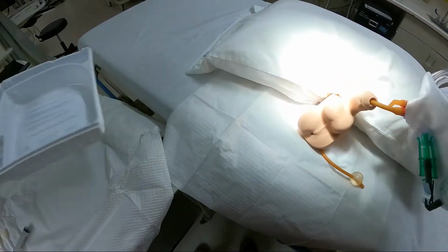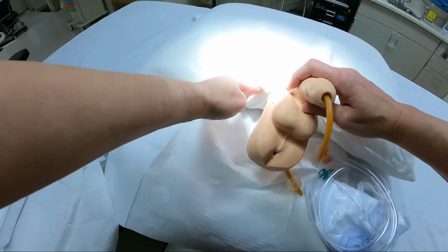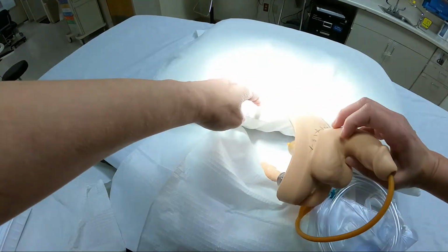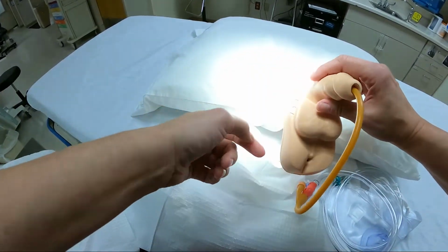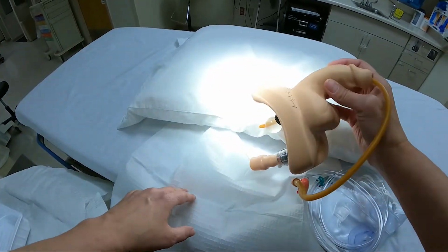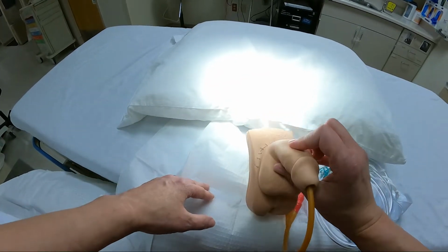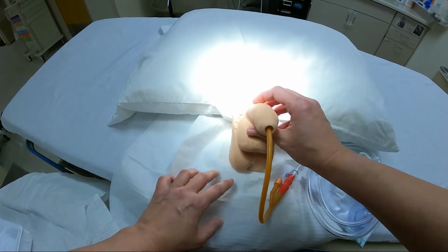Wash your hands. Then you're going to pull this back. Actually, you're going to do that before you put everything away and wash your hands. But you're going to pull this back until it's nicely snug. You don't yank it. You just want the excess to come back. And there you go for the backside view. And this patient has had a very bad trauma, so he's been sutured up. Hence, we're okay with the catheter. So he's been stapled up.